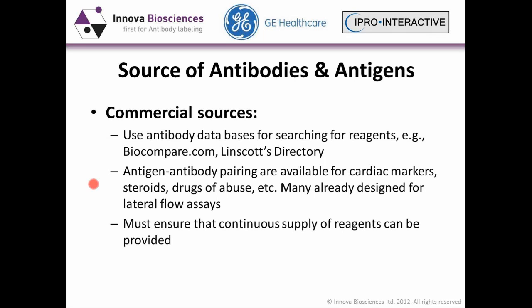Whatever the source of the antibody or the antigen, one must ensure that the supplier can guarantee or secure continuous supply of the reagents.